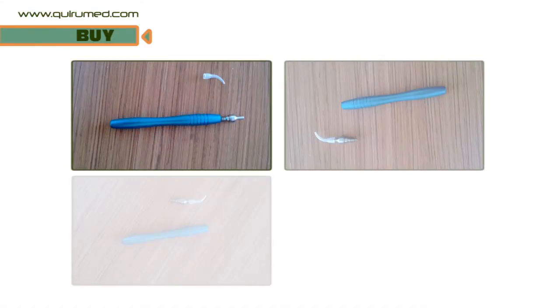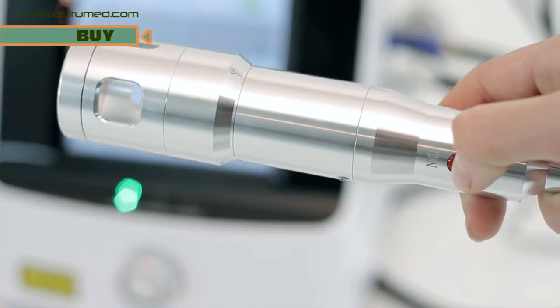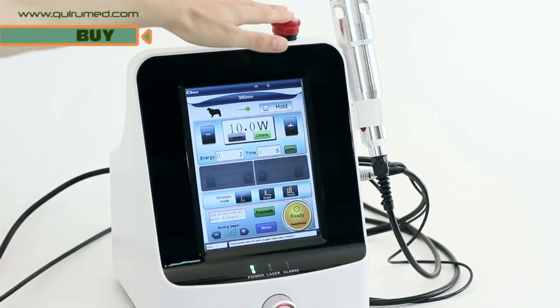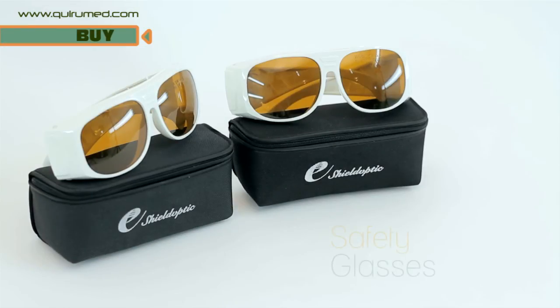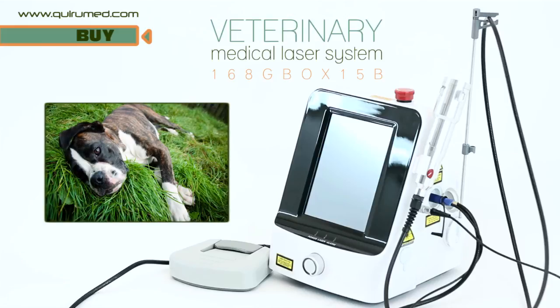Following these steps will guarantee proper connection of the fibre optic cables in the handpiece. For therapeutic treatment, you must adjust the parameters and begin the treatment by pressing the switch on the handpiece. You can instantly stop the treatment by using the emergency stop. For yours and your pet's safety, always wear safety glasses. With a professional veterinary laser, your pet will get a better quality of life without resorting to invasive techniques.